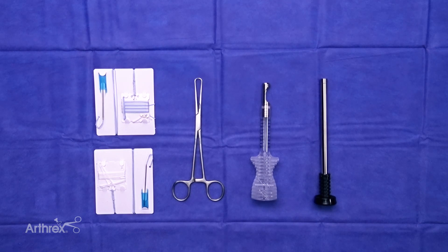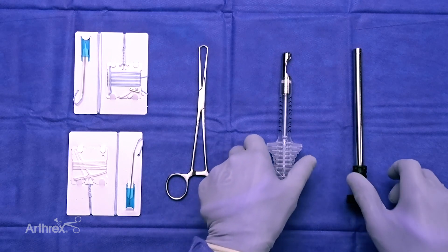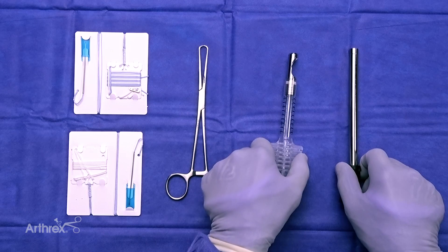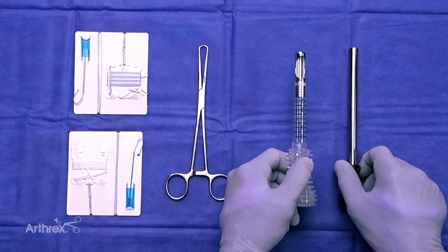In the first generation of the quad harvester, it required careful dissection. Even with a small incision, there was extensive removal of soft tissue impeding the tendon stripper. It was very difficult as we worked proximally into the thigh to get our tendon released enough to finally cut at the desired length. The team at Arthrex has designed a one-step harvester stripper, giving us the opportunity to choose a graft between 8, 9, 10, or 11 millimeters — a circumferential soft tissue or bone quad tendon graft that is much easier and more accurate to harvest.